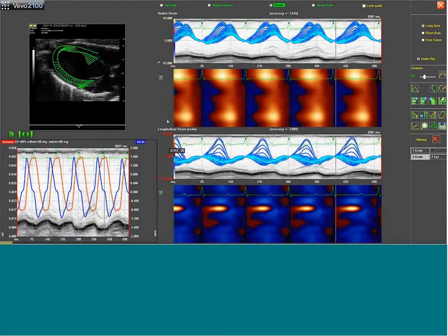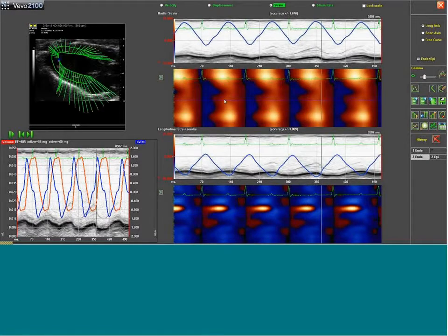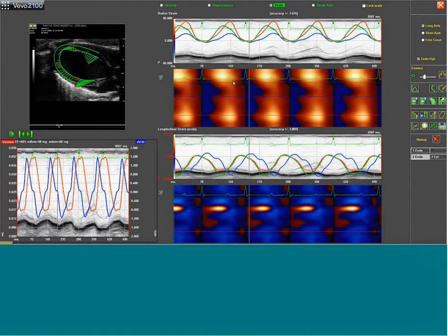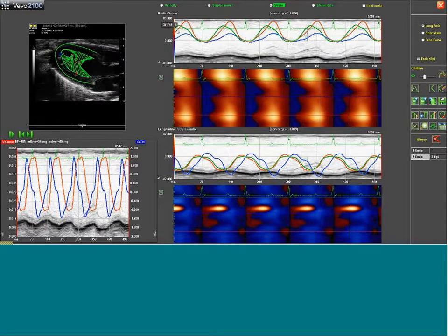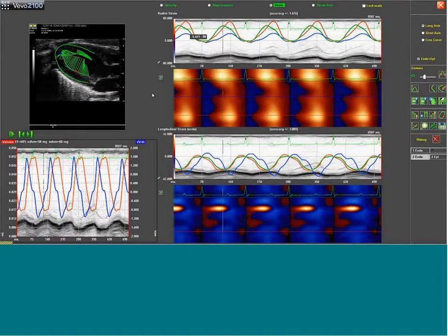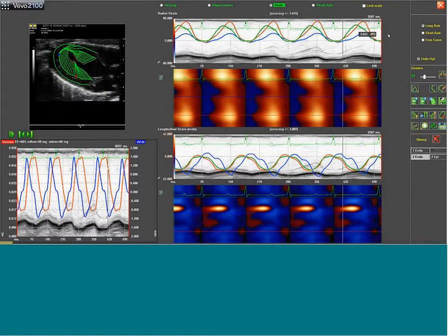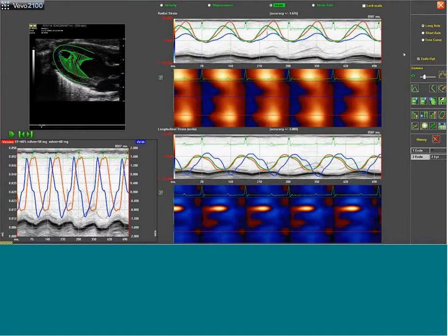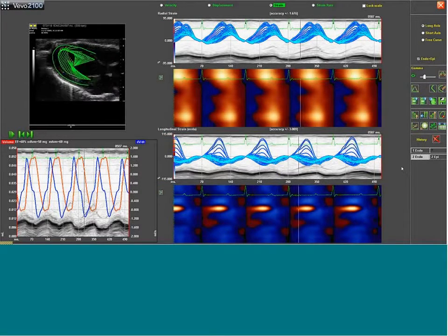In the graphs, you get a mapping of all points. You can select a few individual points — for example, placing a point at the apex shows those specific dots on the tracing. This gives you individual lines for just those selected points rather than all 48 at once. You can choose 2, 3, or 4 points in different sections, getting both longitudinal and radial data for those points. You can cycle through velocity, displacement, strain, and strain rate. To go back to mapping all points, just click reset.